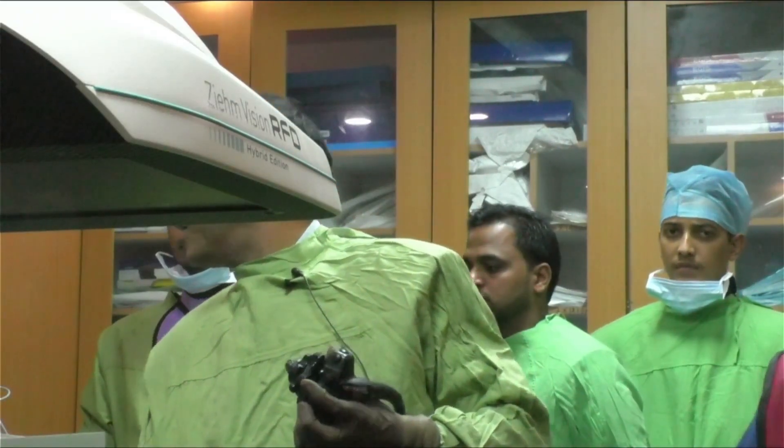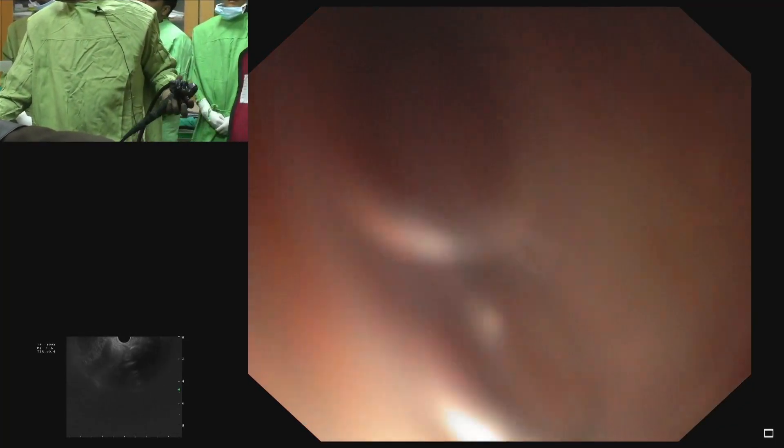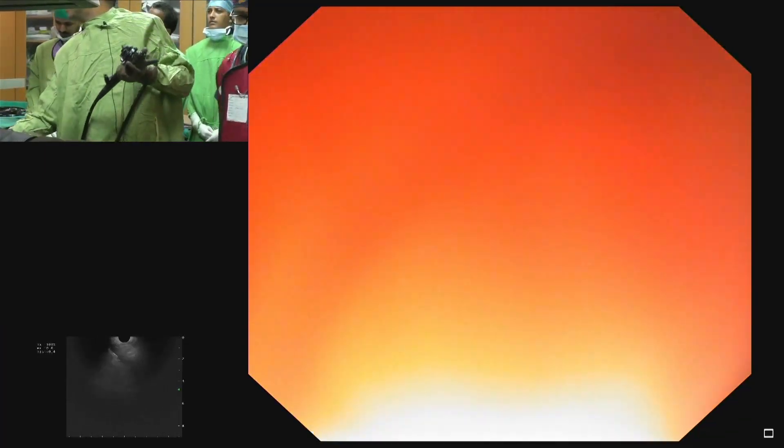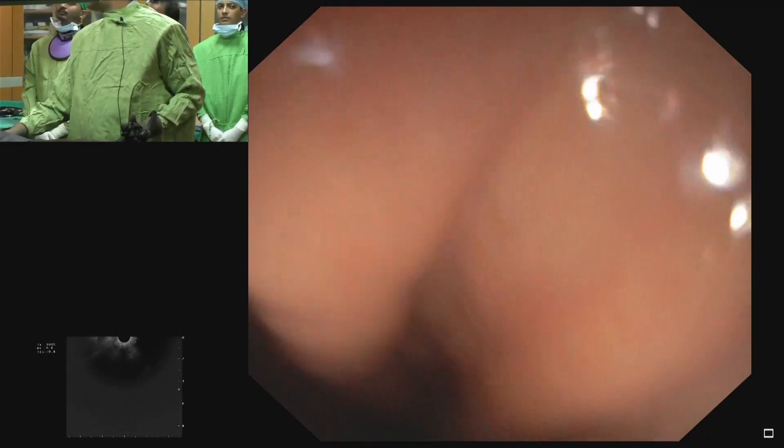We go inside. Here we can see the tongue. We go below the tongue, then we go slightly on the left side, push in and then clockwise. That's how we go beyond the blind area across the upper sphincter. Here we can see the esophagus and now we are into the stomach.